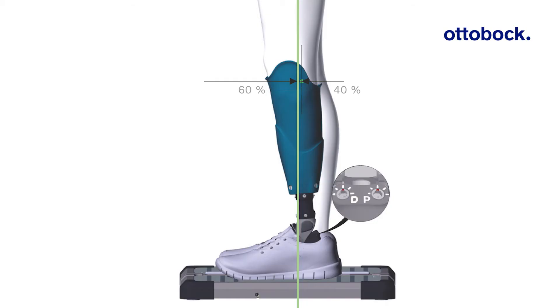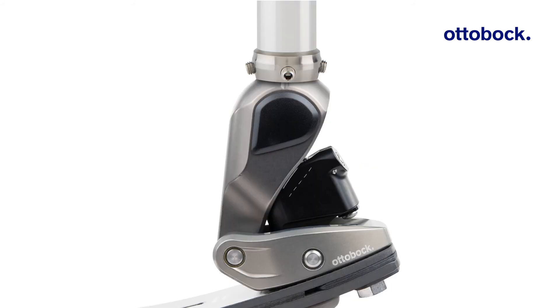The load line should run on or close to the alignment marking on the ankle. Be aware that in a balanced ankle position, the load line can be closer to the knee center than the standard 3D laser posture recommendation values for transtibial and transfemoral prostheses. This is due to the special teleo adapt kinematics.